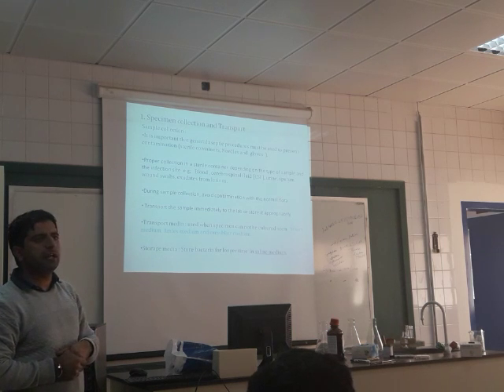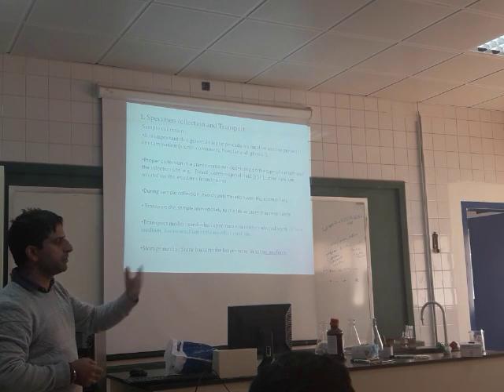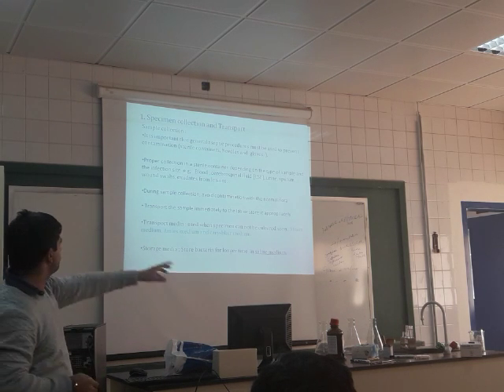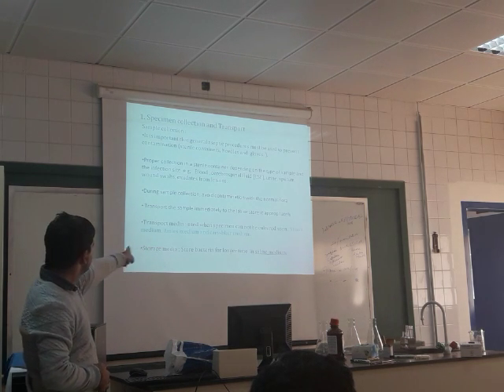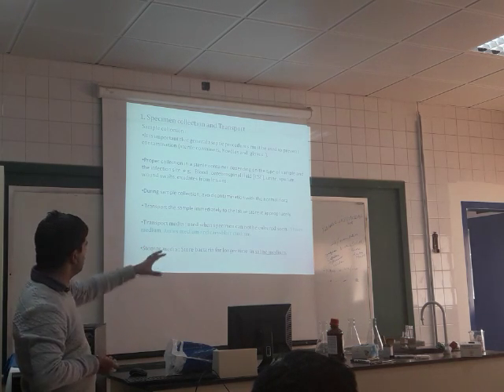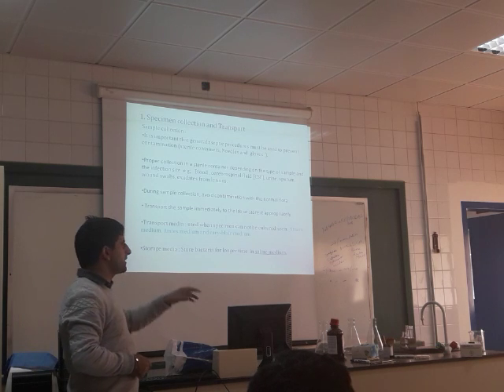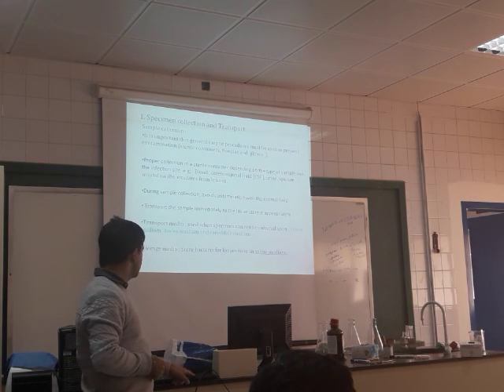If the sample will be processed after 3-4 hours or maybe on the next day, we can use transport media like Stuart's media, Amies media and Cary-Blair media. All of these are called transport media. You can store the bacteria in normal saline for a longer period of time.